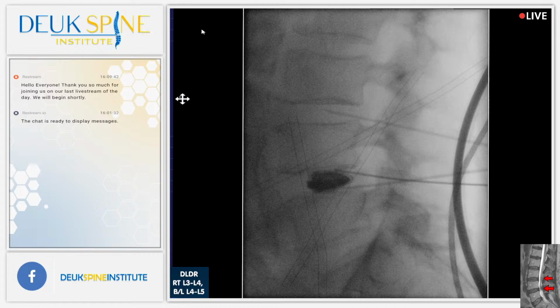Jordan, on that lateral x-ray? Yeah, you can see a blush there. No, further back. Other way. Towards the foramen. Keep going. You see that? Yes, you see that shadow?